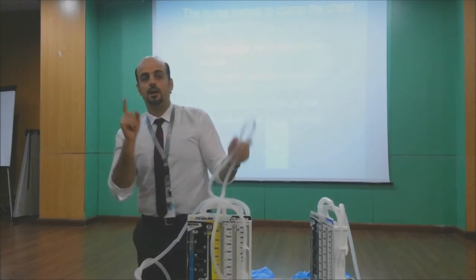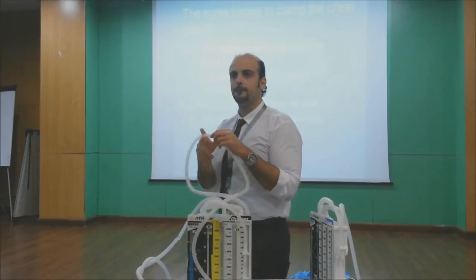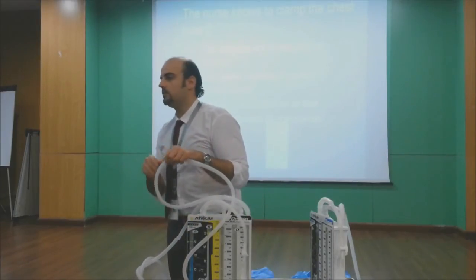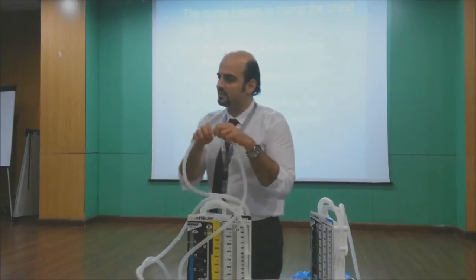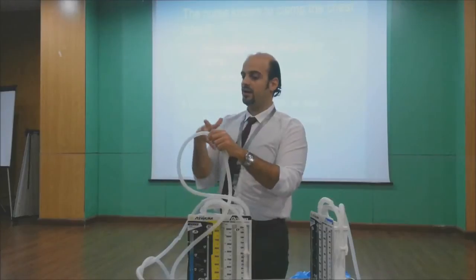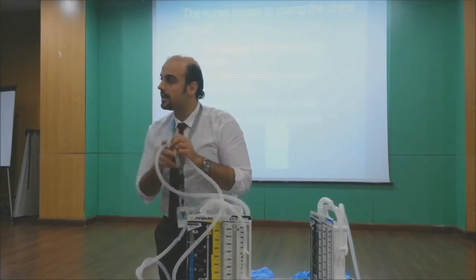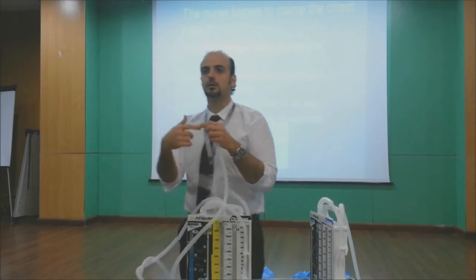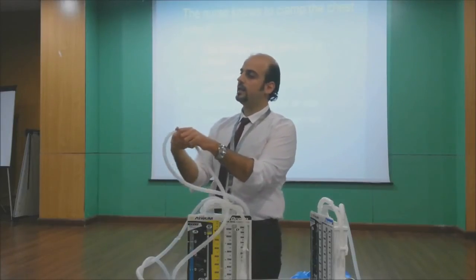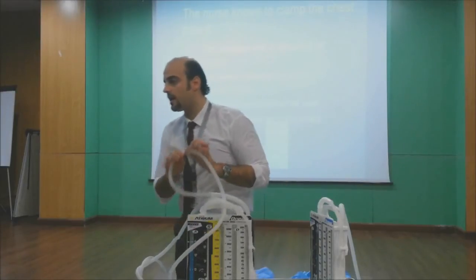By the way, the right way to clamp the chest tube by the clamp that we have. Clamp or artery? No, it's wrong. This tube actually is fragile. Okay, you can see it. It's good, but it's fragile to the metal. So if I clamp it by a clamp like this, it may be micro-injured and air will come inside. So what will happen? Put a gauze. Don't put the clamp like this. No, put the back of the clamp and close it on the gauze. This is the right way to clamp.